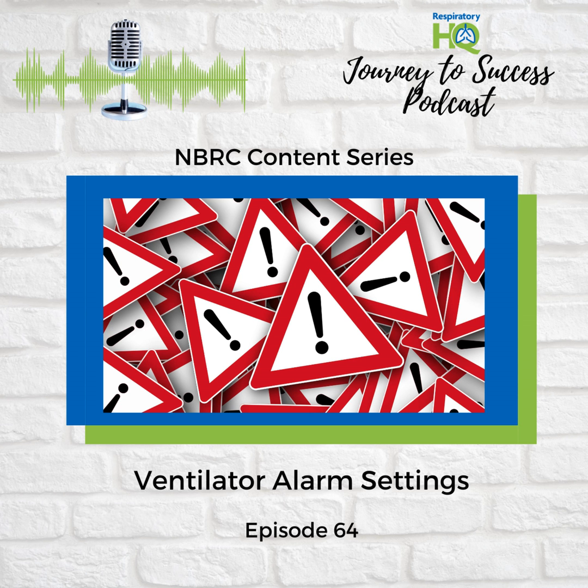Good question. So an event is basically any condition or occurrence that needs the clinical team to be aware and probably take action. These events tend to fall into two main buckets. First, you've got technical events. These are things going wrong with the ventilator itself, unintended changes in its performance. Okay. So like the power going out or maybe an issue with the air supply. Things originating with the machine. Exactly that, like a warning light in your car.